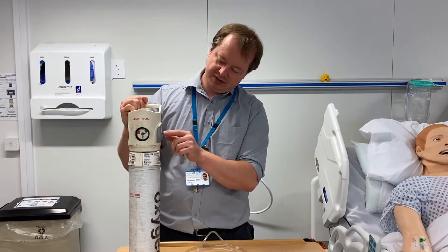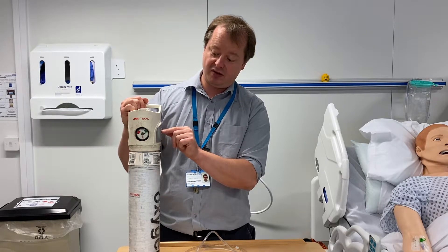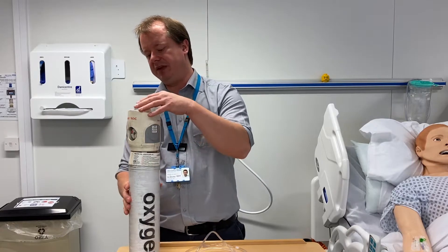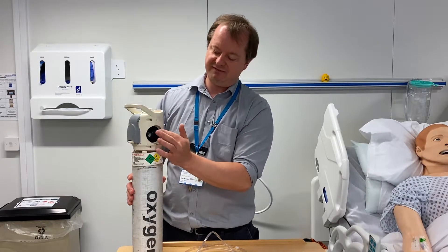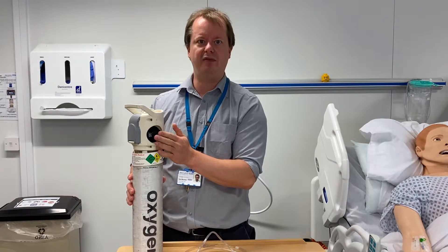If we do some checks on the cylinder we also need to look for the expiry date. This oxygen expires on the 28th of April 2023, which is quite a specific date. When we first get the oxygen cylinder, we'll notice it has a valve on the side which can sometimes be covered by a kind of cap that you'll have to pull off to expose the valve.